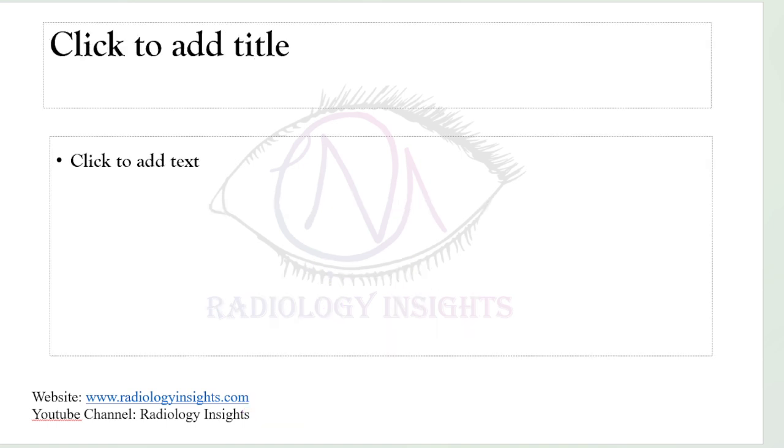The second step after development is to fix the image. The image is fixed by an acid solution of thiosulfate.